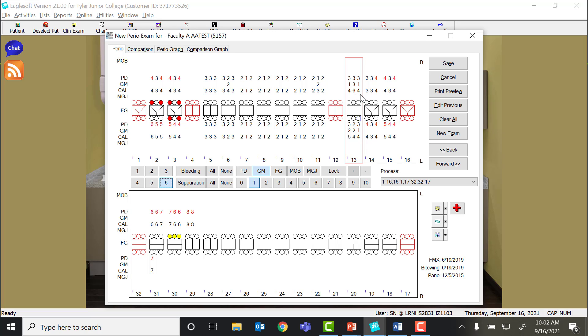So visualize the actual tooth where the CEJ is, where the gingival margin is, and where the epithelial attachment is. EagleSoft automatically calculates the clinical attachment loss for you. No matter what, clinical attachment loss is always CEJ down to epithelial attachment. It doesn't matter where the gingival margin is. I'm going to say that one more time. Clinical attachment loss, or level, is always equal to CEJ to epithelial attachment.